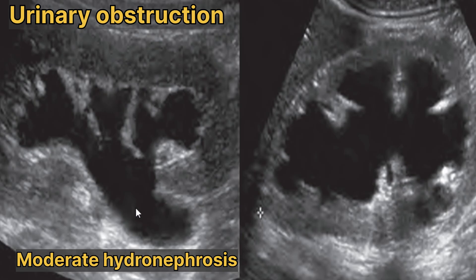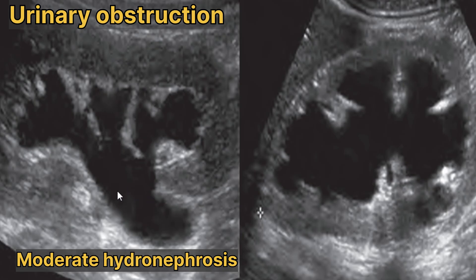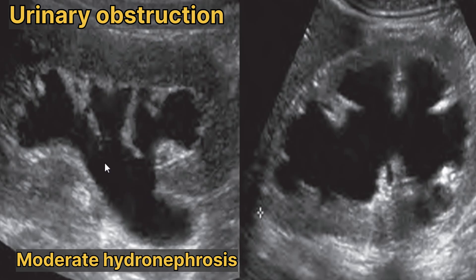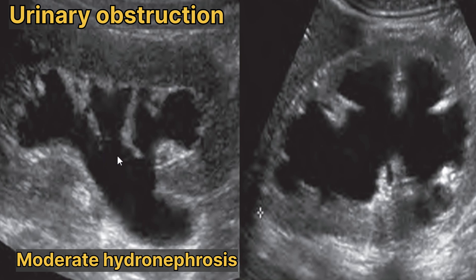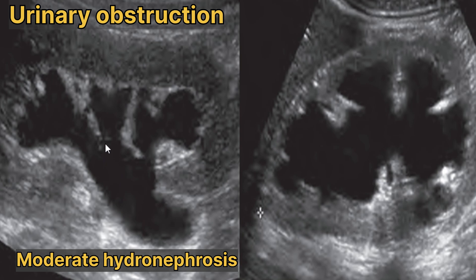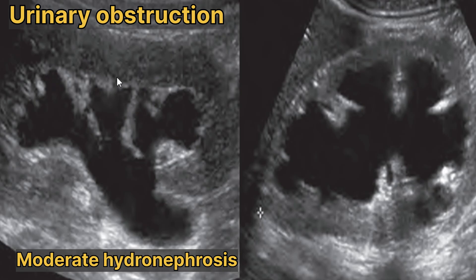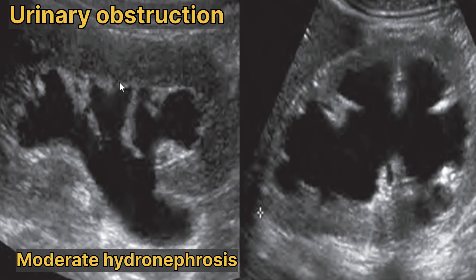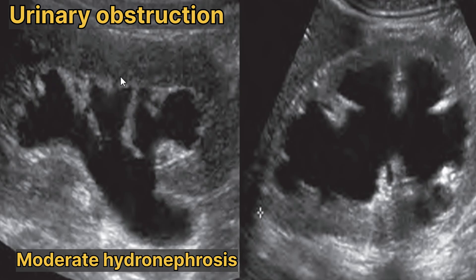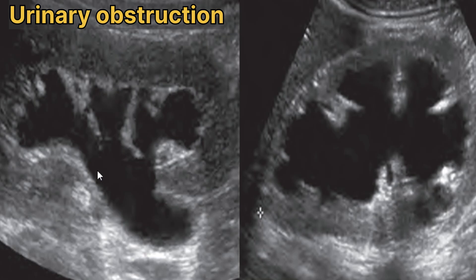Grade 2, or moderate hydronephrosis, refers to dilatation of the collecting system that is readily evident but is not associated with cortical thinning. Here we can see that the cortex of the kidney is almost normal and does not show cortical thinning.